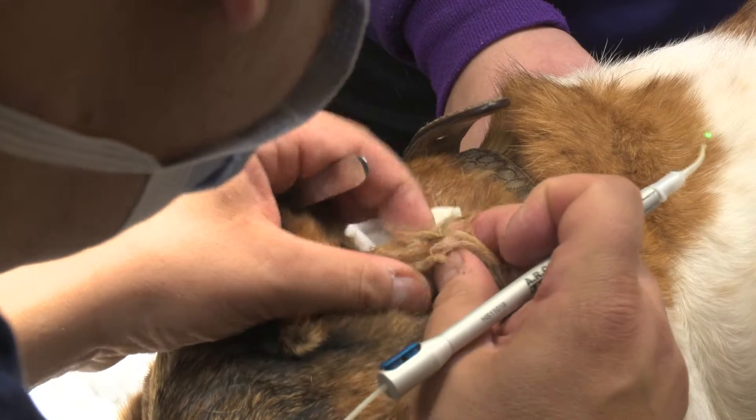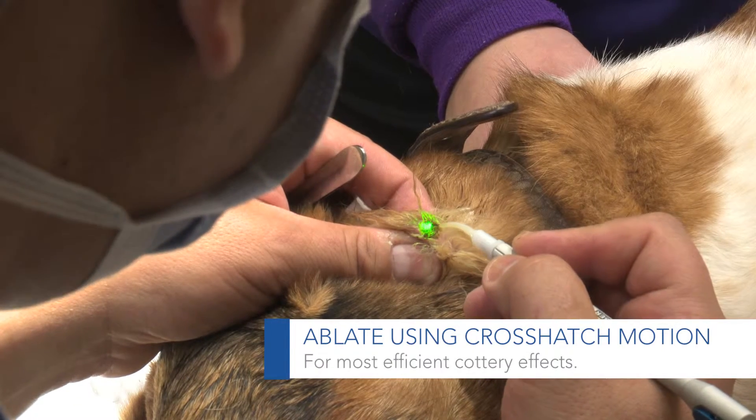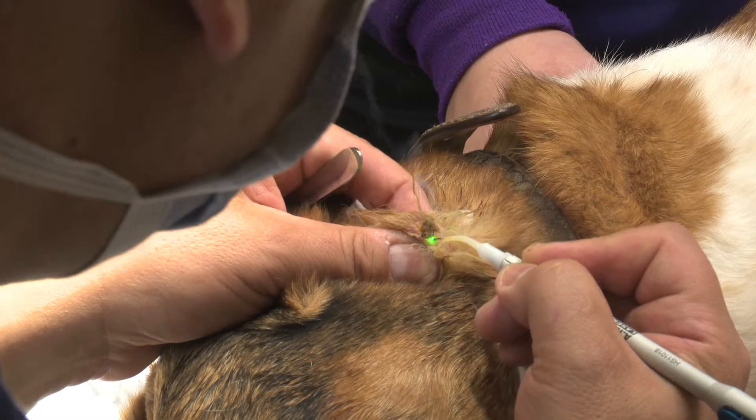I'm going to pick it up again, roll it between my fingers, make sure we don't have any other residual mass there. I'm still going to cauterize that moistened tissue that's right there. You can see we've got a nice caramelization over here.